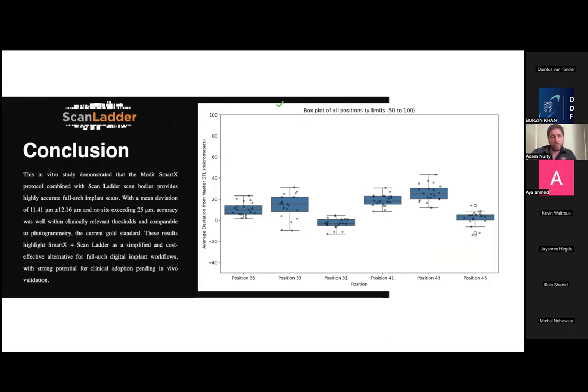We're looking at the overall data spread. We want to make sure the data is spread in a really confined spread, so that the worst case scenario and best case scenario are all well within what would be needed to have a passive result. We don't just want to have a good mean, but then the spread is massive.